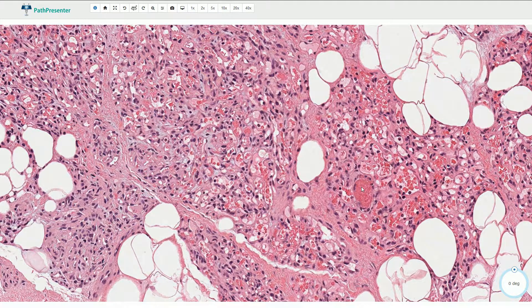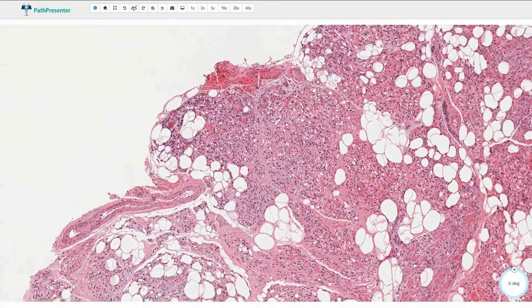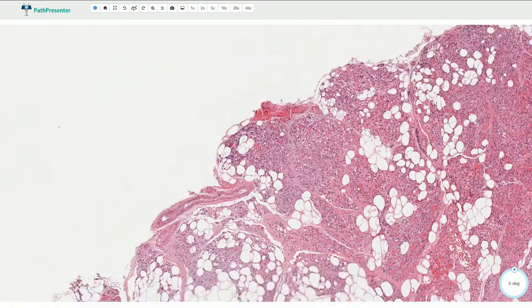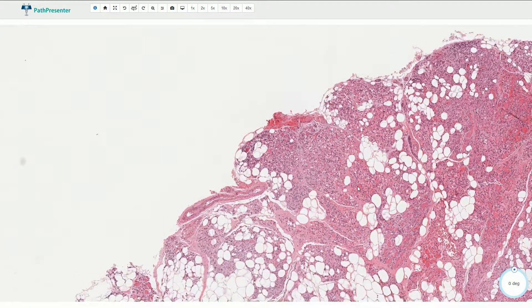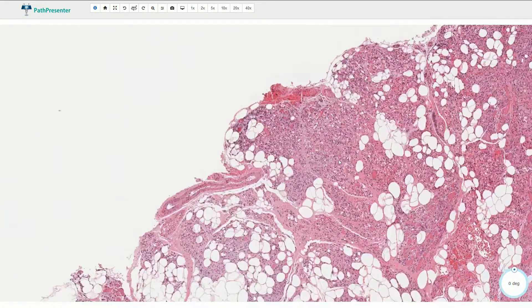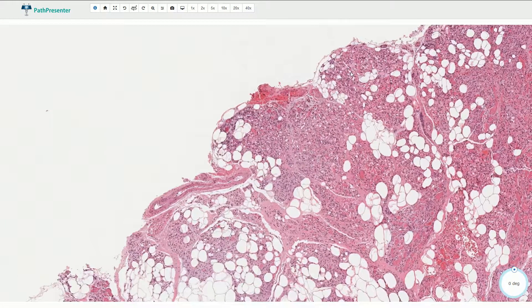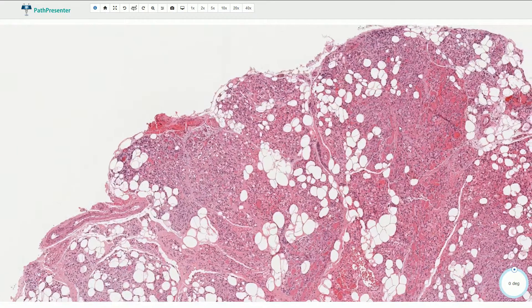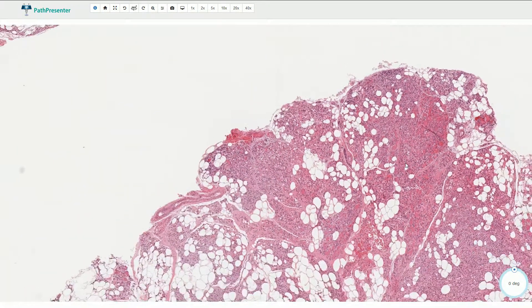Cases with a very prominent vascular component are called cellular angiolipomas. For example, if the tumor looks like this throughout all areas, that could be an example of a cellular angiolipoma.